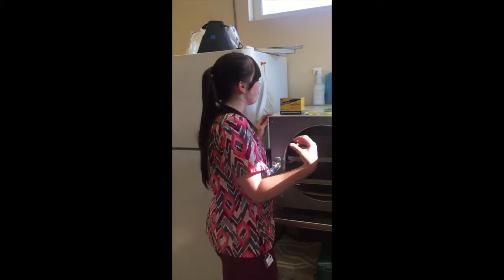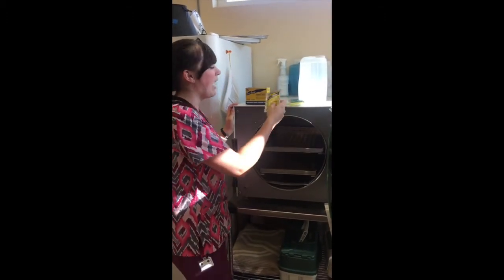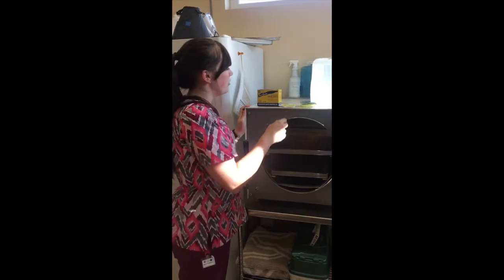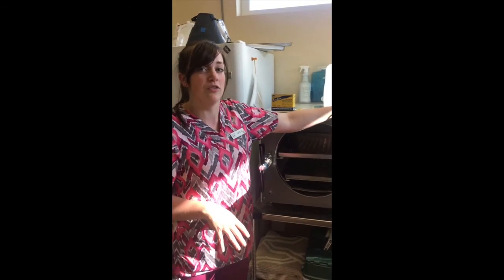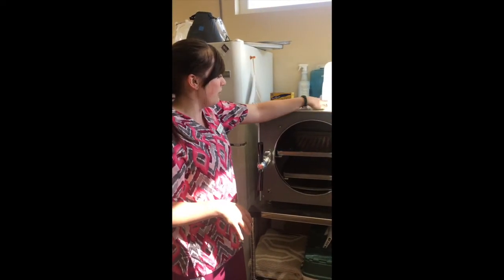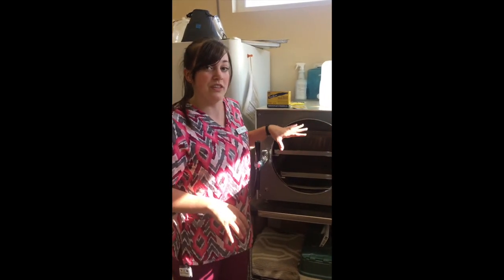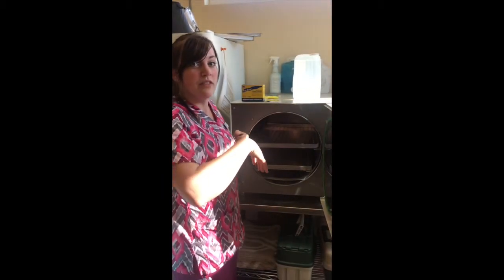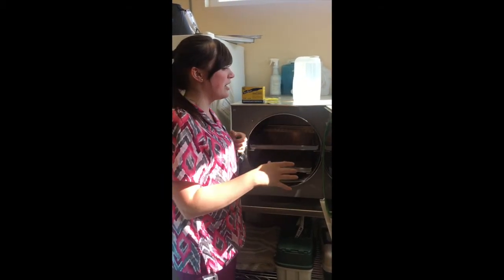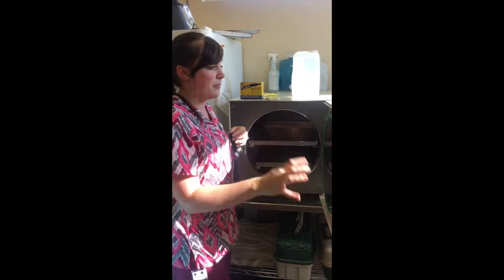When we have those removed, we want to clean the inside of the autoclave and the door. We have cleaner that we use. We open that cleaner and put it inside, and we refill with brand new, fresh distilled water, and we gently scrub over the inside of the autoclave with the cleaner in it, and that makes it clean. Then once that's done, we run a full cycle, and that'll flush the system and make it really clean.